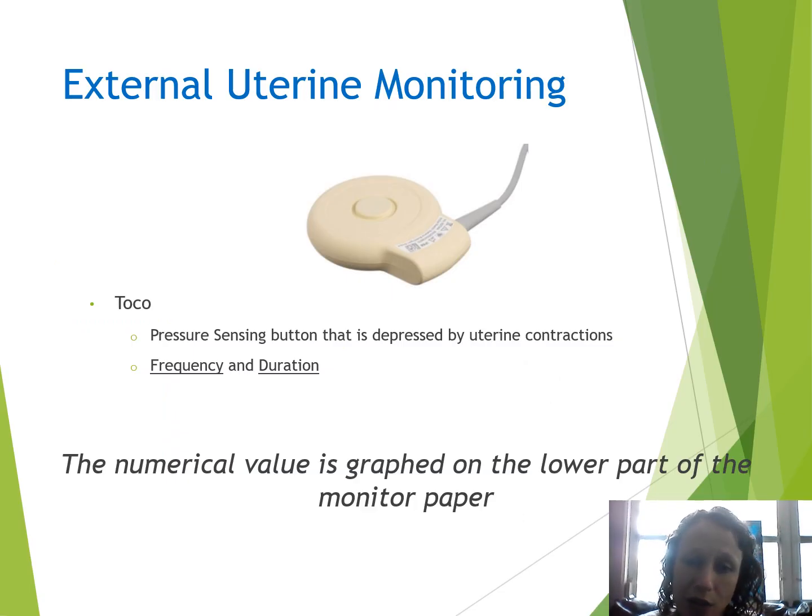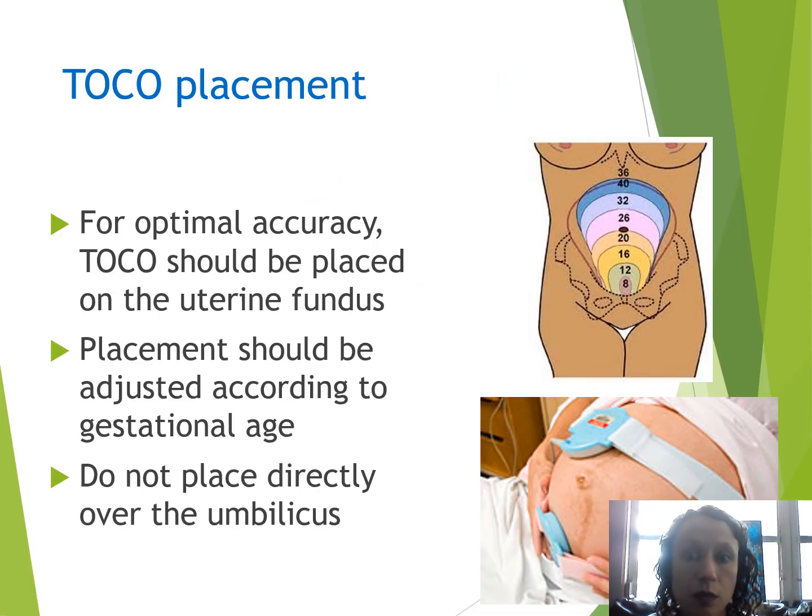We talked about how the TOCO doesn't really measure how strong, but it does get frequency and duration as long as it's placed properly. Of course, all monitors can be wrong. So it's just a little review about how the fundal height is. We don't want to ever place it over the umbilicus. It just does not measure correctly. This is why TOCOs can be a little tricky. They are a flat monitor and they go on a round belly. So that makes it a little bit harder. So you have to kind of play.